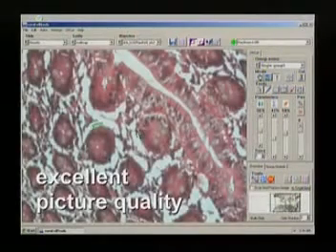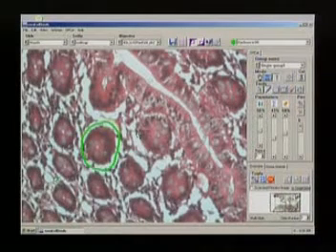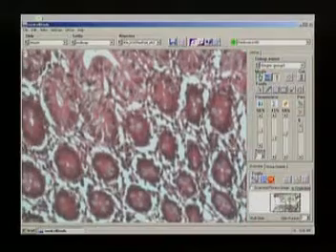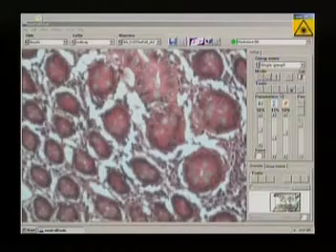The excellent picture quality allows simple and fast identification of the targeted cells. Encircle the cells which are to be isolated using a computer mouse or a digital pen screen, then just click on the cut button to start the automatic cutting procedure.